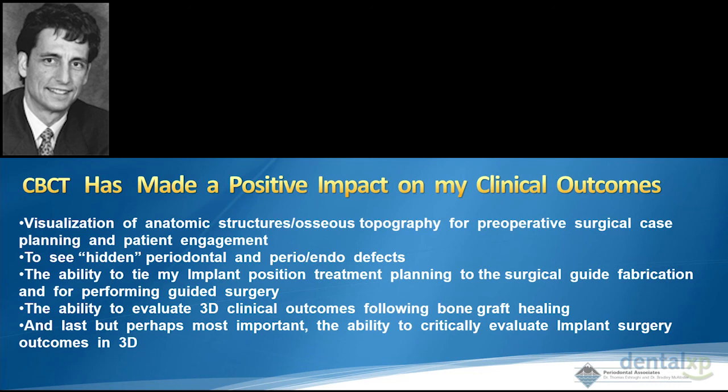And then, the last but probably the most important, is the ability to critically evaluate your implant surgery outcomes. What that means is that you and your own skill set, you've seen some outstanding clinicians today, and you'll continue to see that. But for me, I'm kind of your average surgeon in the office. I want to make sure that I know what works for me. What works for Danny Boozer may not work for us. What may work for Dennis Tarnow may not work for us. So you want to make sure that you know what works in your hands and that you've evaluated it, so that you can make a decision for yourself what incision designs work for you, what bone graft materials work for you, and what kind of timelines will work for you so that you get the most successful outcomes.